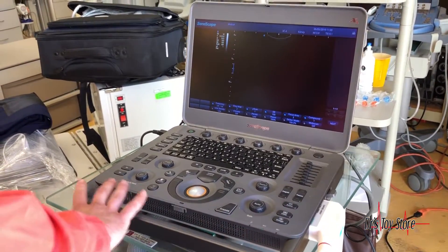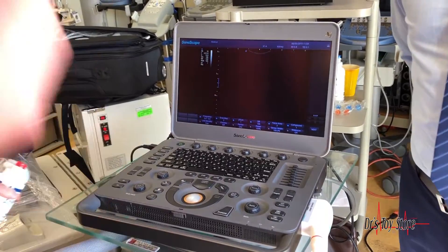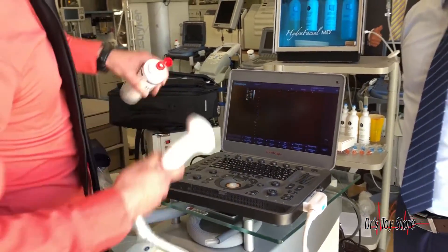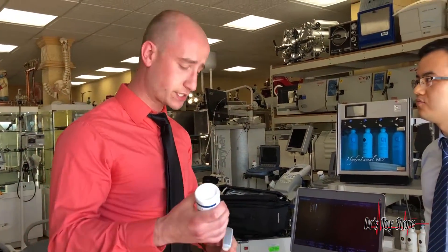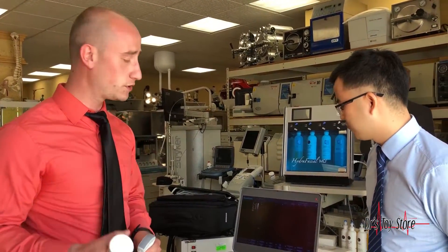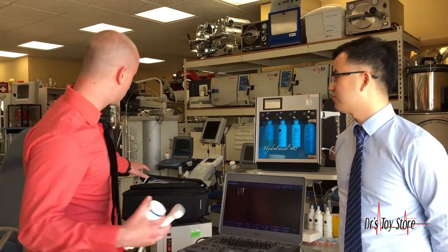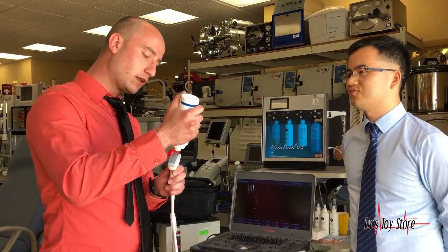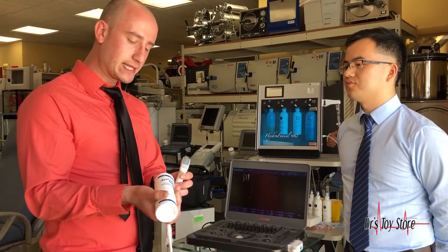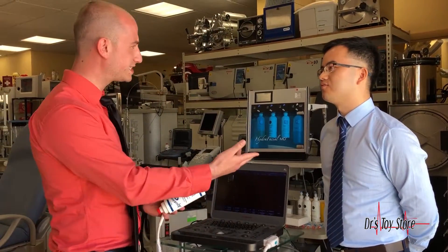As you can tell, the sleek design — it's like a flat screen — it's very, very good for taking on the road. If you're running a diagnostic center going to different doctor's offices, you want something with a sleek design. Put everything in a box like a suitcase and you have different probes you can use. What I love about this system is the very high frequency. The curved array probe goes from one to seven megahertz.